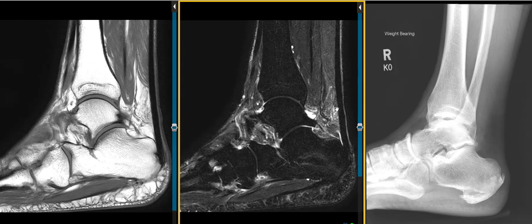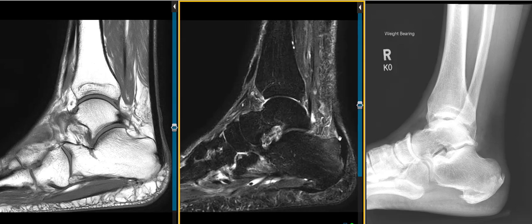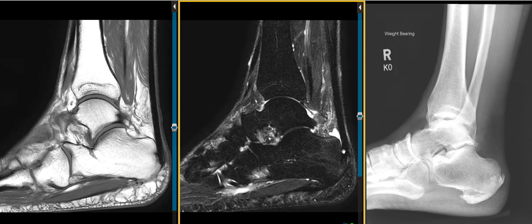So very mild peritendinitis with retrocalcaneal bursitis and Achilles tendinopathy with retrocalcaneal spurring, just bread and butter findings in this patient with heel pain. And that's it.